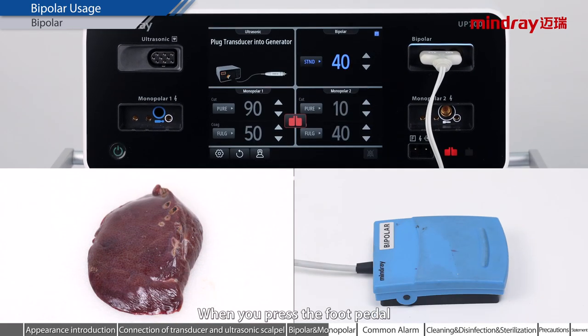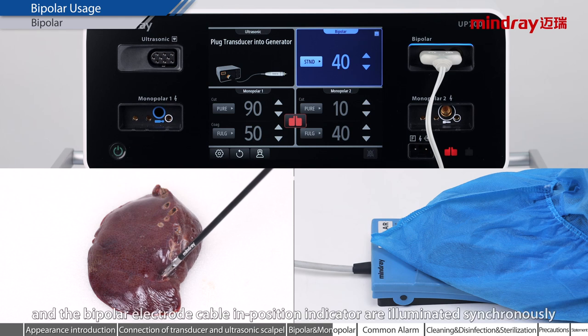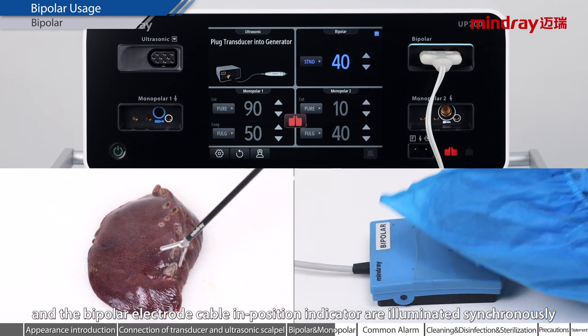When you press the foot pedal, the bipolar energy can be normally output. At the same time, the bipolar functional area and the bipolar electrode cable in-position indicator are illuminated synchronously.